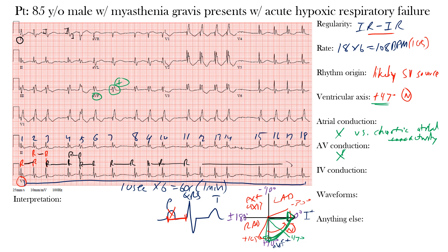Next, intraventricular conduction. We look at the duration of the QRS complexes — normal QRS duration is between 70 and 110 milliseconds, or about two to three small boxes. The QRS complexes do appear wide here. In fact, the QRS duration was 132 milliseconds, confirming prolonged intraventricular conduction.